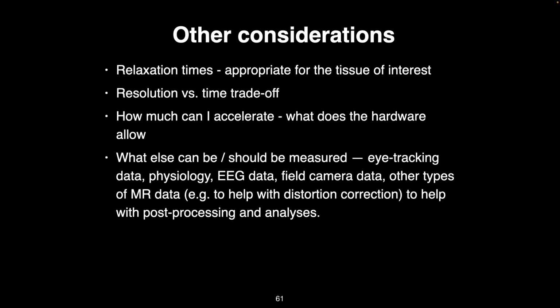I think one of the biggest questions people have to answer, I always get the question, I want the whole brain and I want it in half a second. But as you can see, when we're talking about acceleration and resolution and how much time it takes and how hard you can drive your gradients, these are all things you have to consider with how much signal you're going to get at the end, and how much noise.